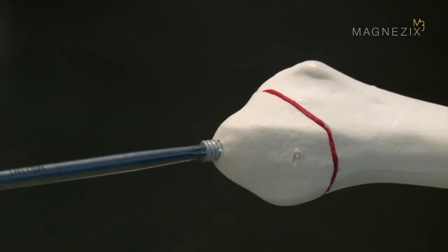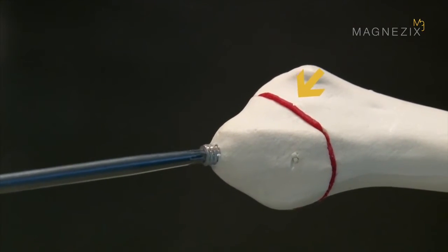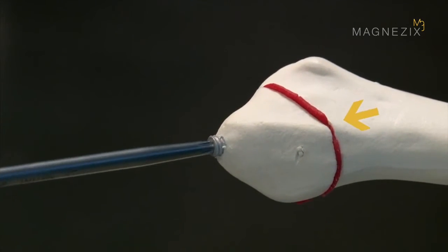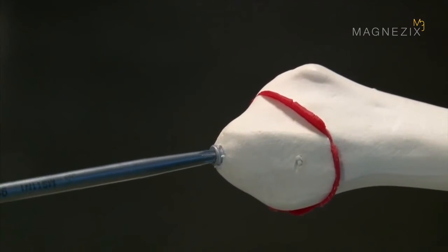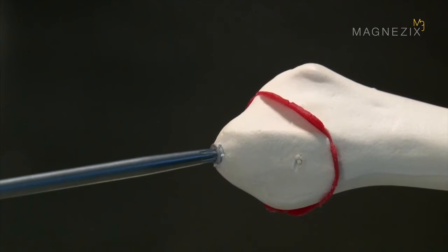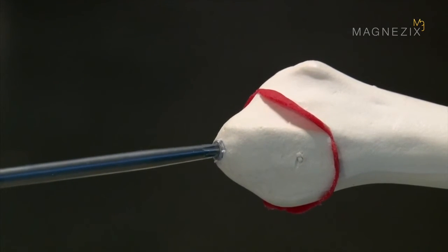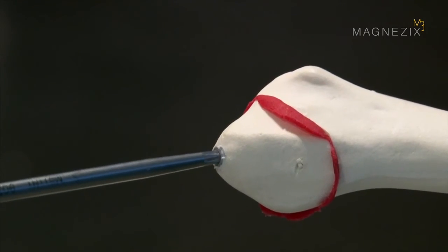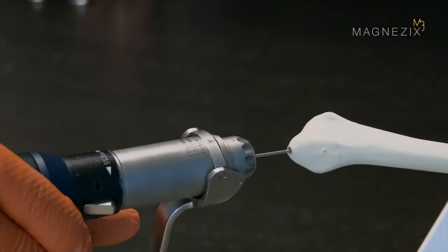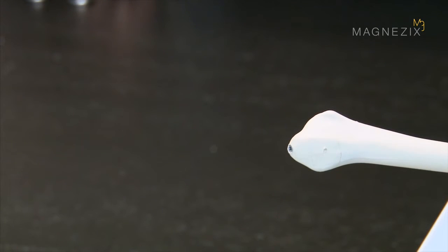When you start tightening the head, you can now see the compression being exerted on the fracture gap. Before finalizing the insertion procedure, remove the repositioning aid to check how much compression is exerted on the fracture gap. After this, the guide wire is removed. The fracture has now been treated.